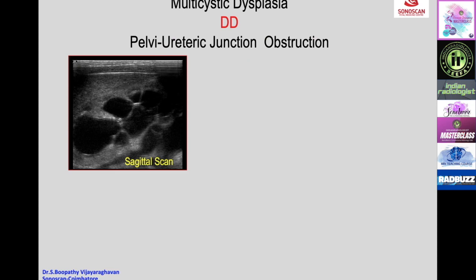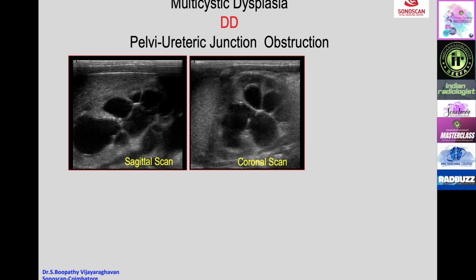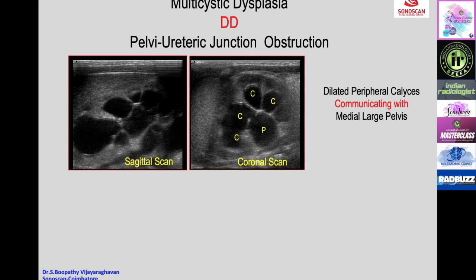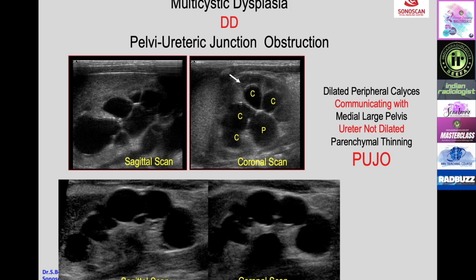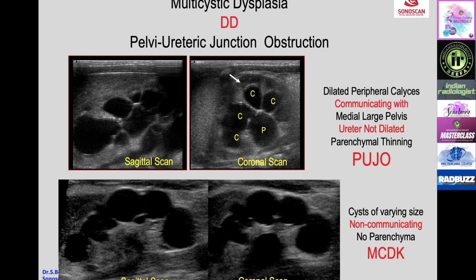Multicystic dysplastic kidney must be differentiated from PUJ obstruction, which can mimic it on sagittal scan. The crucial technique is a coronal scan: in PUJ obstruction, the peripheral calyces communicate with the medial large pelvis, the ureter is not dilated, and there is thinned surrounding parenchyma. In contrast, in multicystic dysplastic kidney the cysts are of varying size, non-communicating—this is the crucial differentiating point—and there is no surrounding parenchyma.